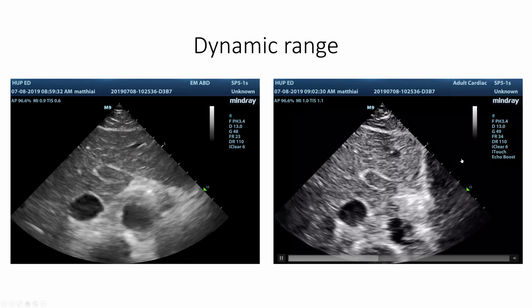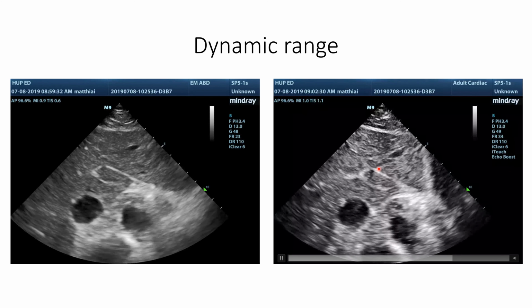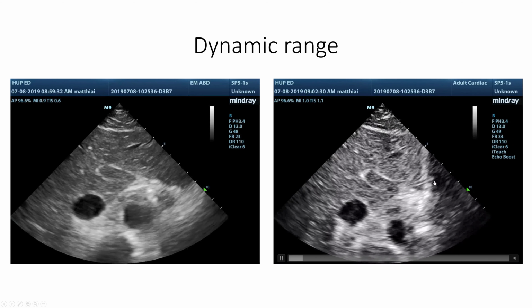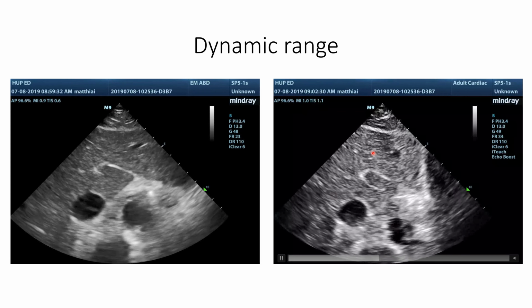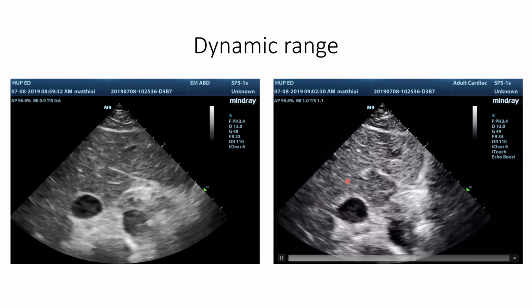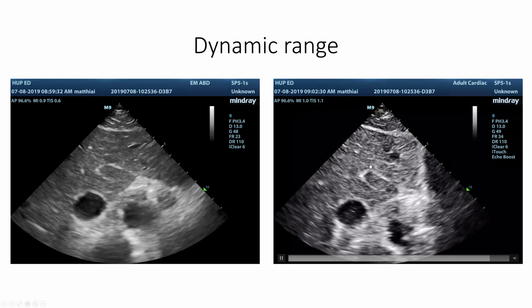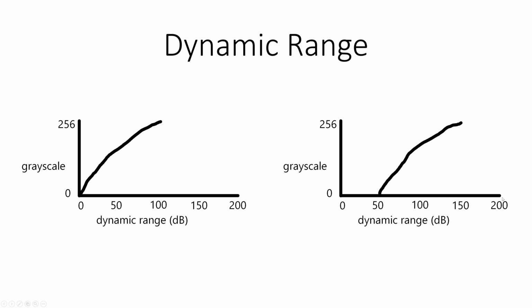You cannot say, oh, darn it, I forgot to switch my preset, but that's such a pain. I've really got my probe in a good spot, and I like how I'm pointed at the IVC. I think I'll just adjust the dynamic range and make this liver parenchyma look appropriate. That will not work because you cannot change the general distribution, the general shape of the curve.